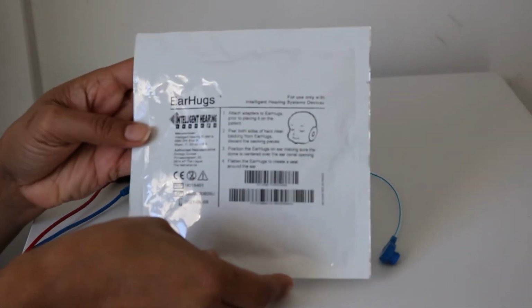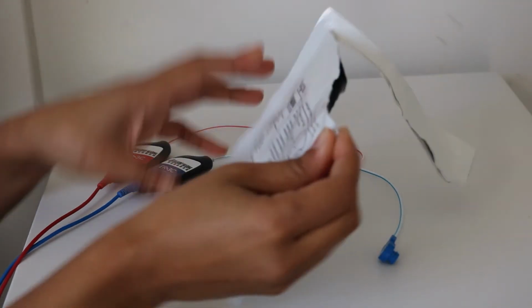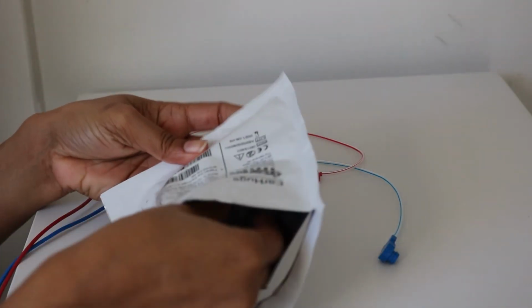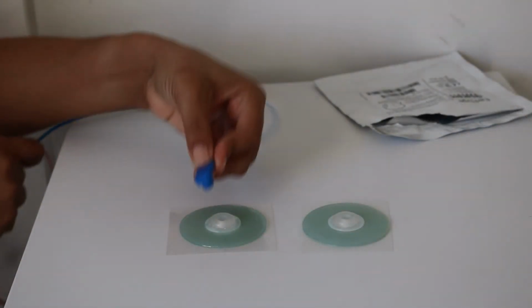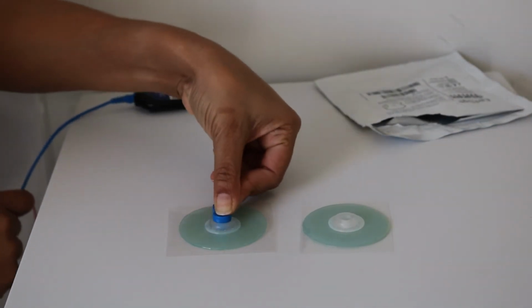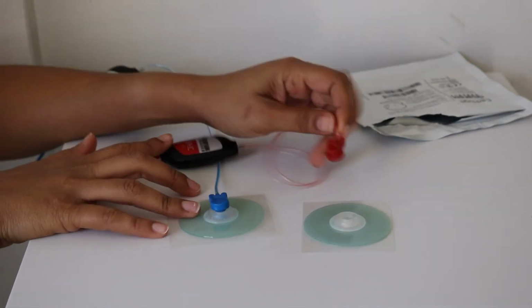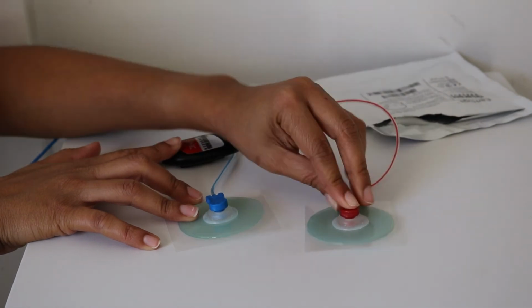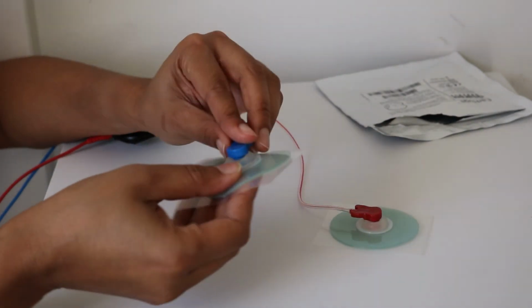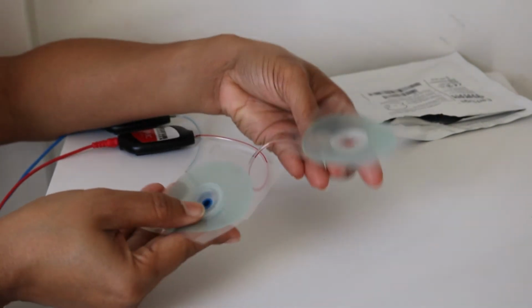The earhugs come as a pair in a pouch. Open the earhug package by ripping the package at the notch, then carefully remove the earhugs from the pouch. Attach the earhug adapter to each earhug prior to removing the clear backing and placing the earhugs on the baby. Use the top of the cart as it is much easier to attach the earhugs on a flat surface. Rotating the adapter while attaching it will facilitate placement.